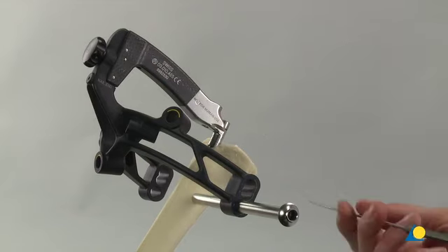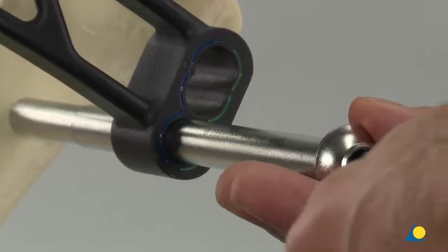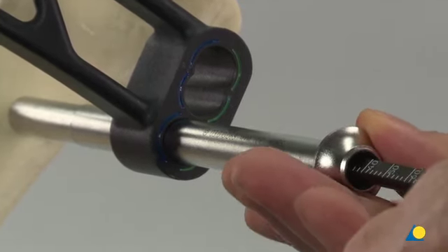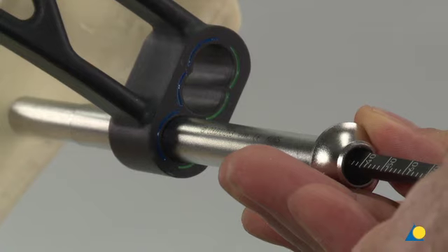While ensuring that the protection sleeve is pressed firmly to the bone, the measuring device is slid through it, making sure that the hook grasps the far cortex. The length of the first locking screw is determined by reading the measurement at the back end of the protection sleeve. In this case, 40 mm is measured.